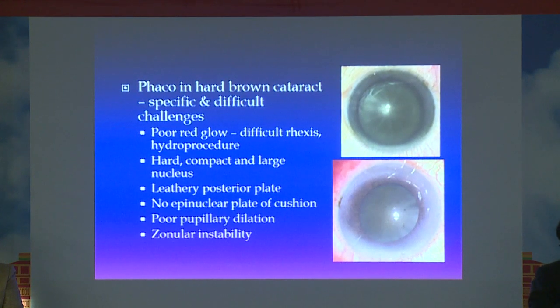Also, they are associated with a leathery posterior plate, which sometimes fails to separate. There is no epinuclear plate or cushion to protect the posterior capsule, and there can be associated poor pupillary dilatation and zonular instabilities.